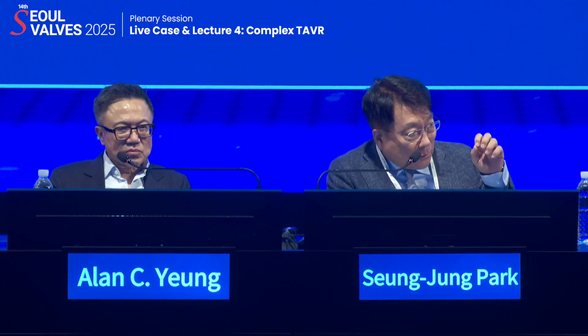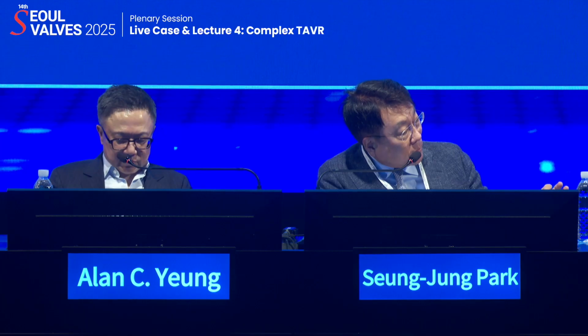Any procedures, even the Sentinel cerebral protection, spend a lot of money, and however, we didn't find any efficacy benefit. So what I want to say is that for any procedures, we have to prove efficacy, and is it really better than the others? As we have to do that, personalized, right? Yeah, but the leaflet cutting device is so expensive, so I think UNICORN is cheaper.